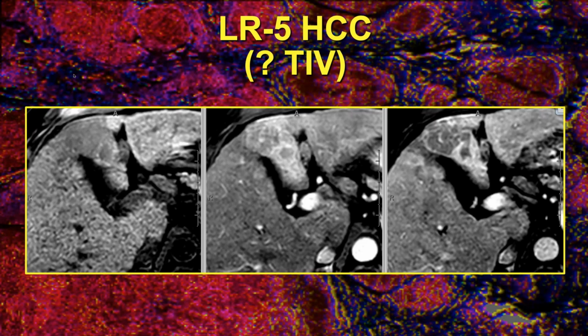So now we'll look at another LI-RADS 5. So this is also definitely hepatocellular cancer. No difficulty seeing that it's hypointense on T1, hyperenhancing, perhaps also a mosaic configuration with very clear washout, so hepatocellular cancer. But the shape looks a bit concerning. It seems to have indistinct edges as you get toward the porta hepatis. I think there's legitimate concern that there could be tumor in vein.